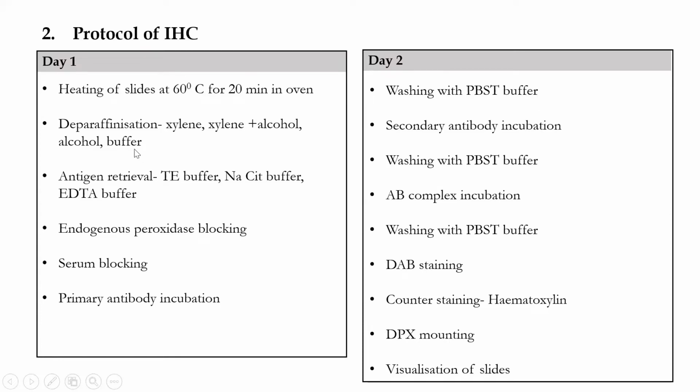Buffer, as we all know, is a solution, mainly water-based, which is able to resist changes in pH. Why do we want to take the tissue from xylene to buffer? Because xylene is non-polar and buffer is polar, and all further procedures of IHC are polar. So we are using water-based reagents.